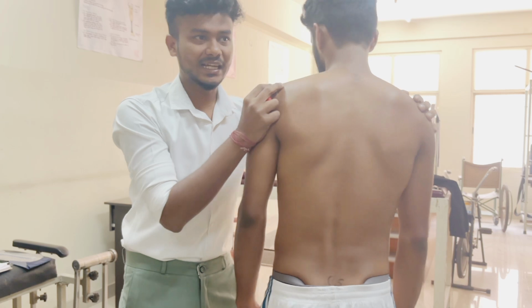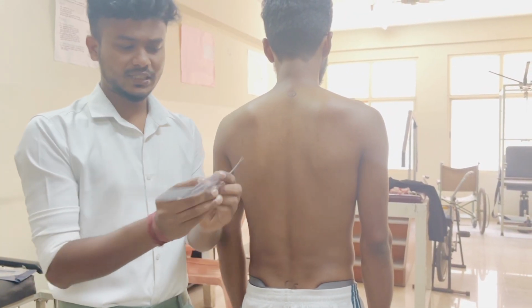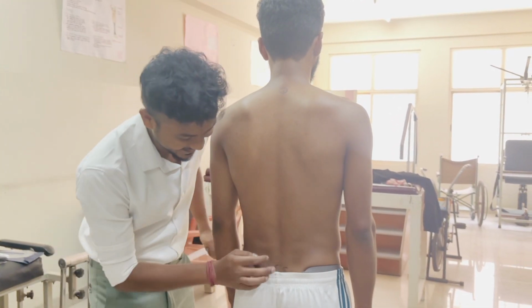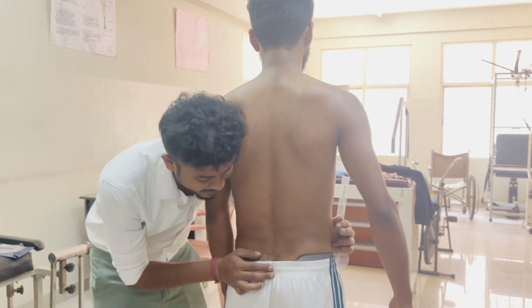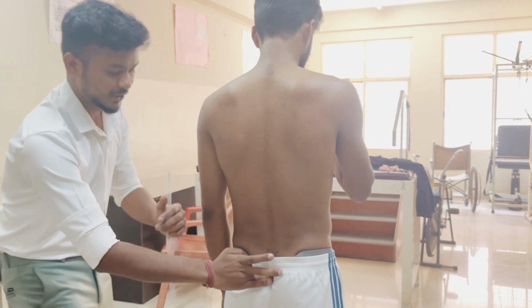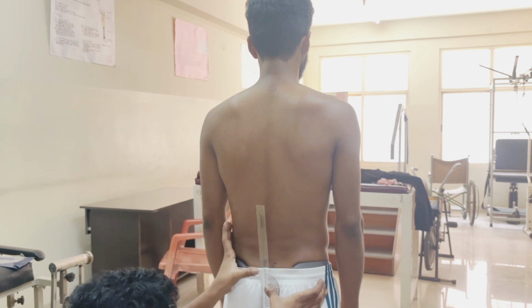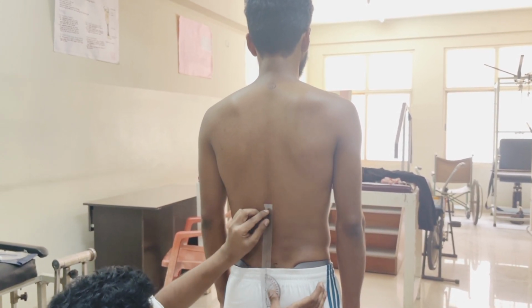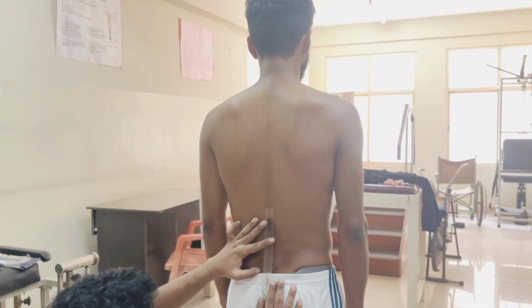Now we will see side flexion. We are going to measure it with a goniometer. This is our L5. Just behind L5 we will be having S1, after that S2. The fulcrum for this movement we are going to keep over S2, and the moving arm goes along the spinous processes of the lumbar and thoracic spine. This is our stationary arm.